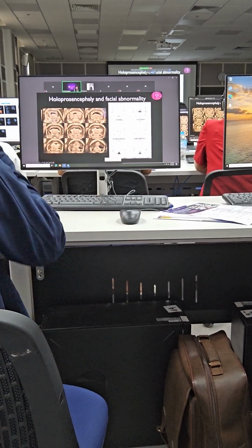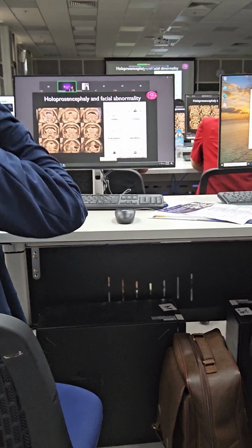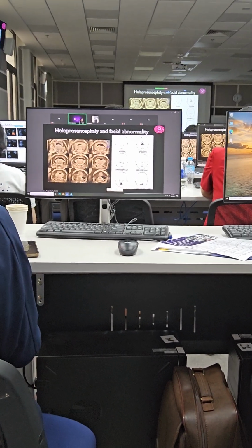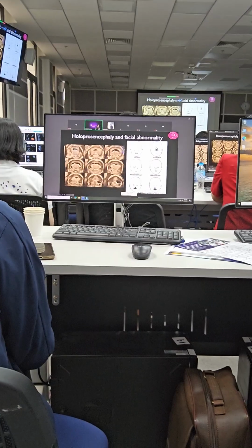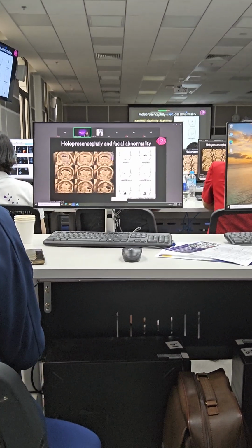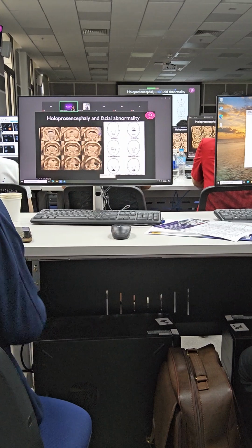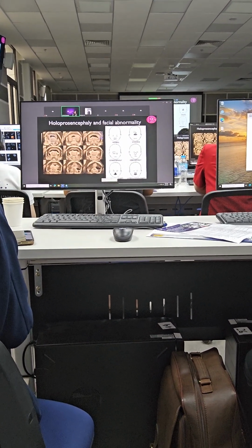Today Tom showed the facial abnormality with holoprosencephaly, with the cyclopia and the proboscis, and sometimes the one nostril, not the two nostrils, and sometimes the cleft lip and palate.